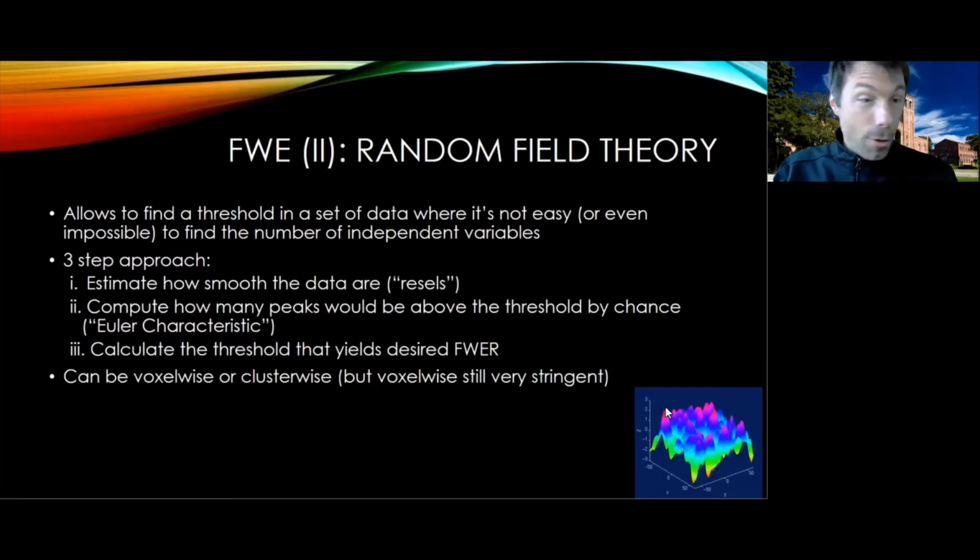The beauty of this is that you can do it either voxel-wise or cluster-wise. We typically discuss it at the cluster-wise level, which is the way I've presented it, just because very few people ever do this at the voxel level, also because it is overly stringent. It's already fairly stringent, I have to say, under the right conditions. At the voxel level, it's even more stringent than at the cluster level.